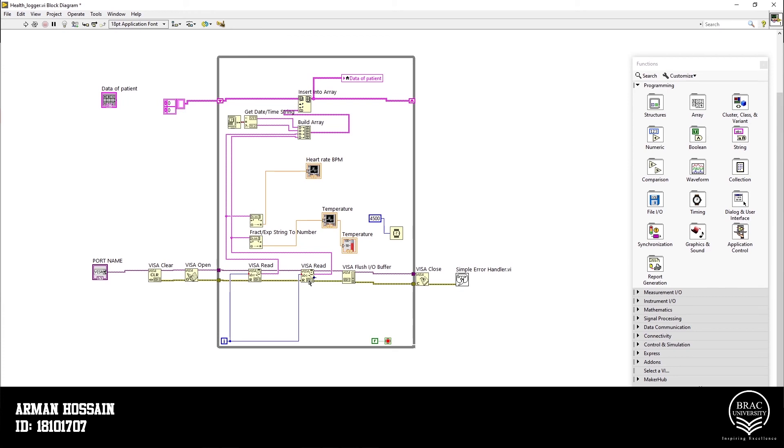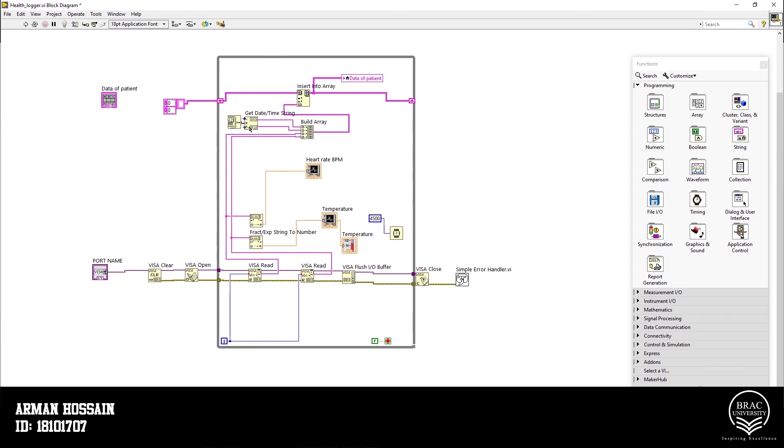Furthermore, since we wanted to show our data graphically, we need numerical value. That's why we use our string to number converter here. Along with that, we need to log our data by date and time. That's why we use get date and time string.